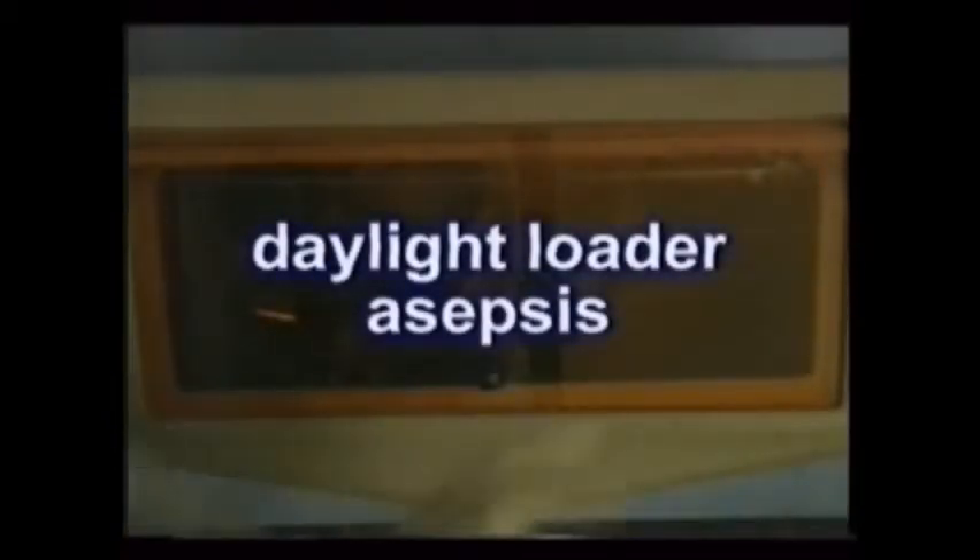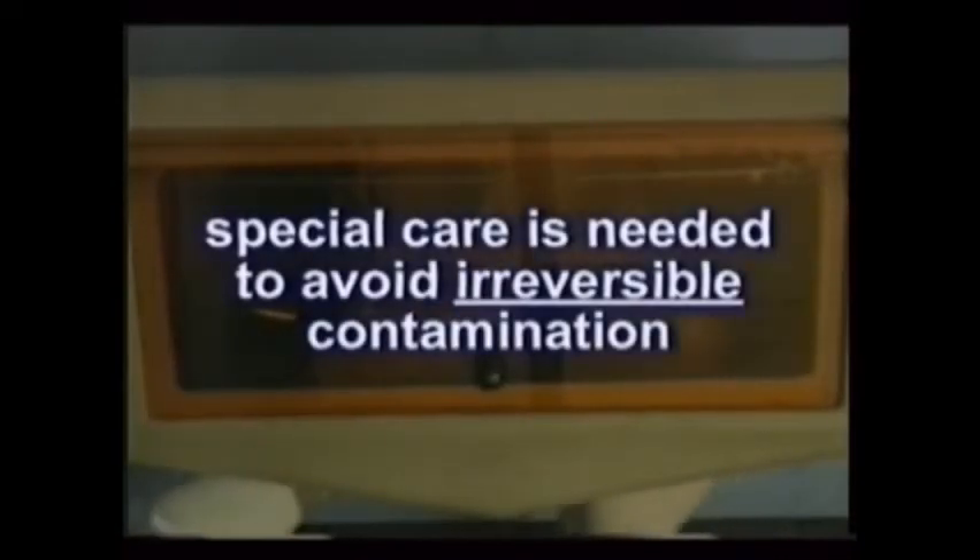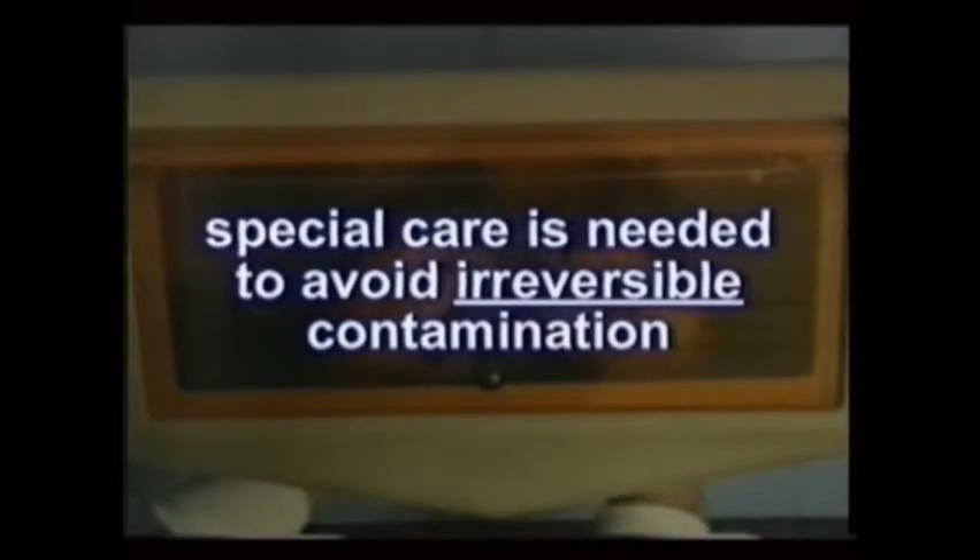Be sure to handle the films by their edges to avoid contaminating them with the powder from the gloves. If either the automatic or the chair-side processor has a daylight loader — which is basically a light-tight box into which you insert your hands through black light-tight openings — special care is needed to avoid irreversible contamination.